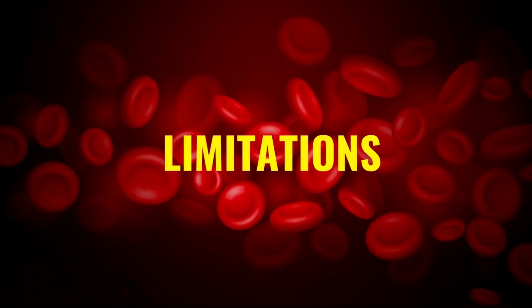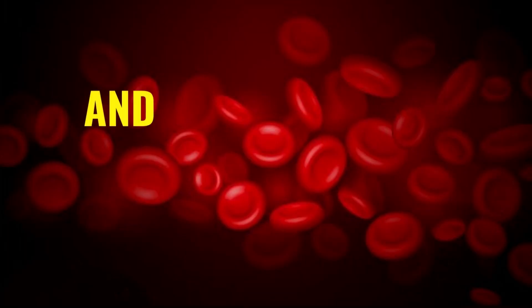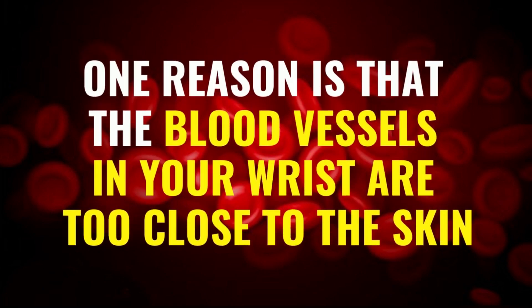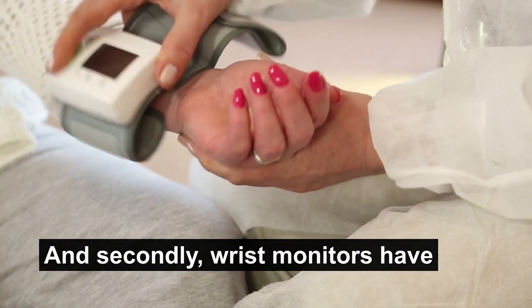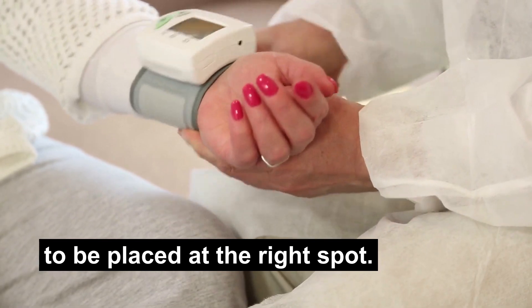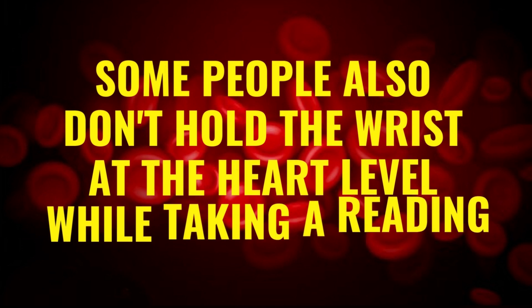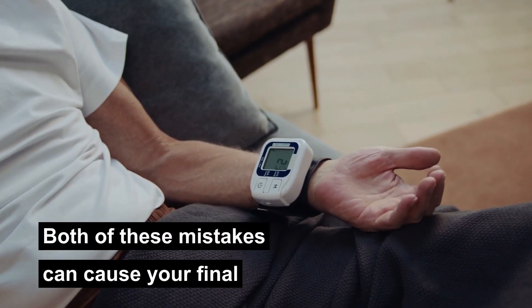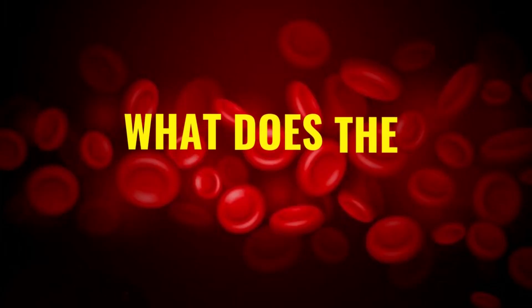Let's talk about the limitations. Wrist blood pressure monitors aren't as accurate as upper arm monitors, and there are two reasons for that. One reason is that the blood vessels in your wrist are too close to the skin, which makes getting the correct reading difficult. Secondly, wrist monitors have to be placed at the right spot — this is where most people make mistakes. Some people also don't hold the wrist at heart level while taking a reading. Both of these mistakes can cause your final blood pressure readings to be inaccurate.